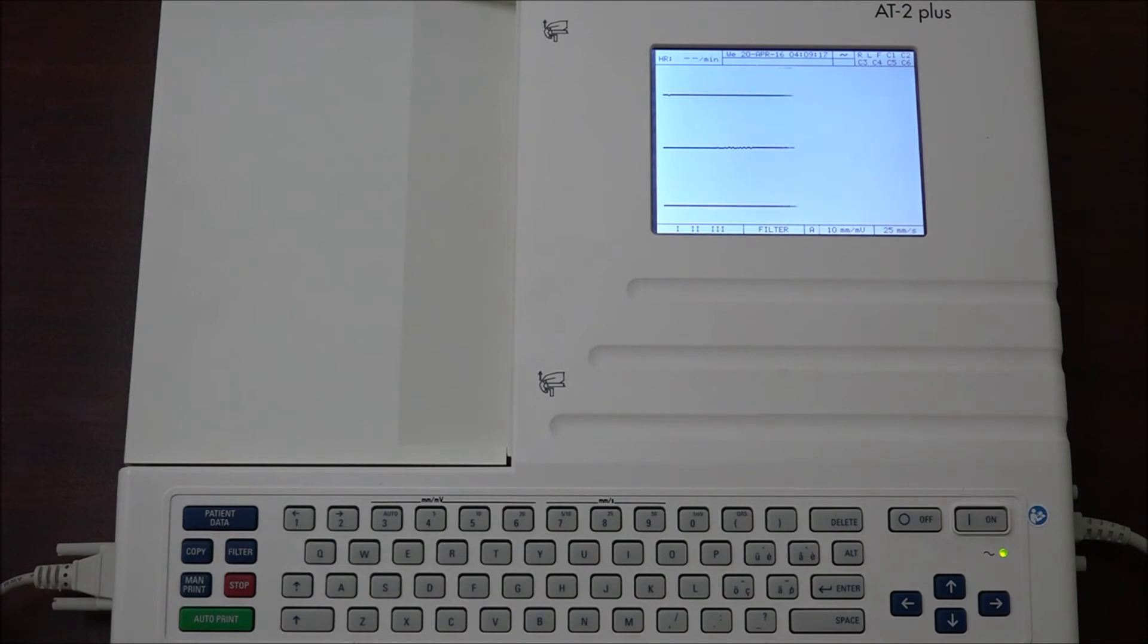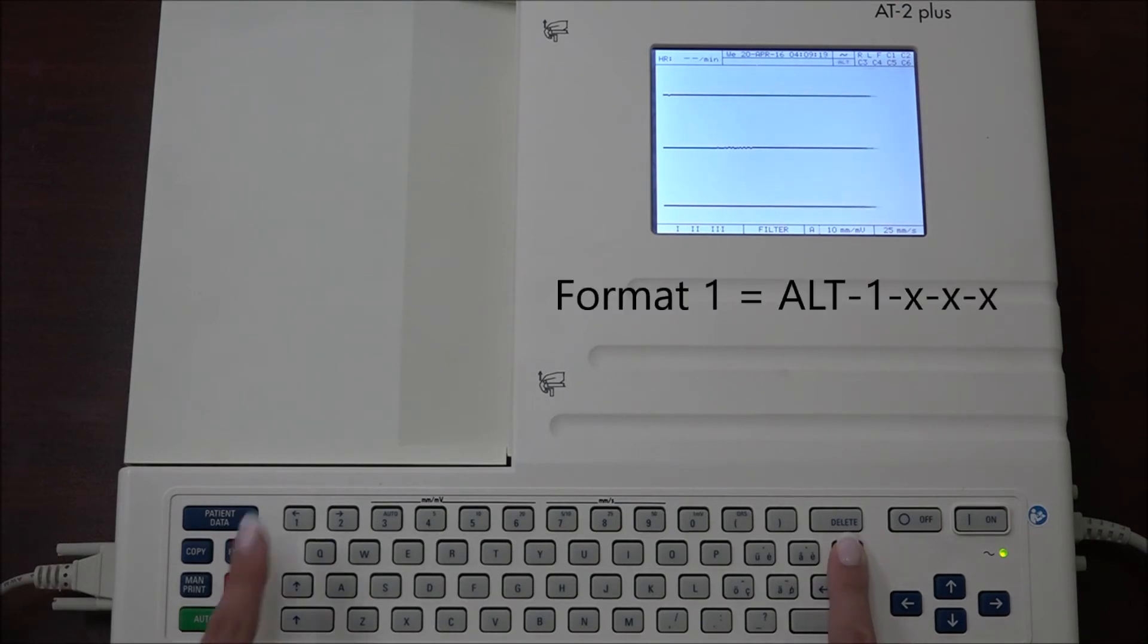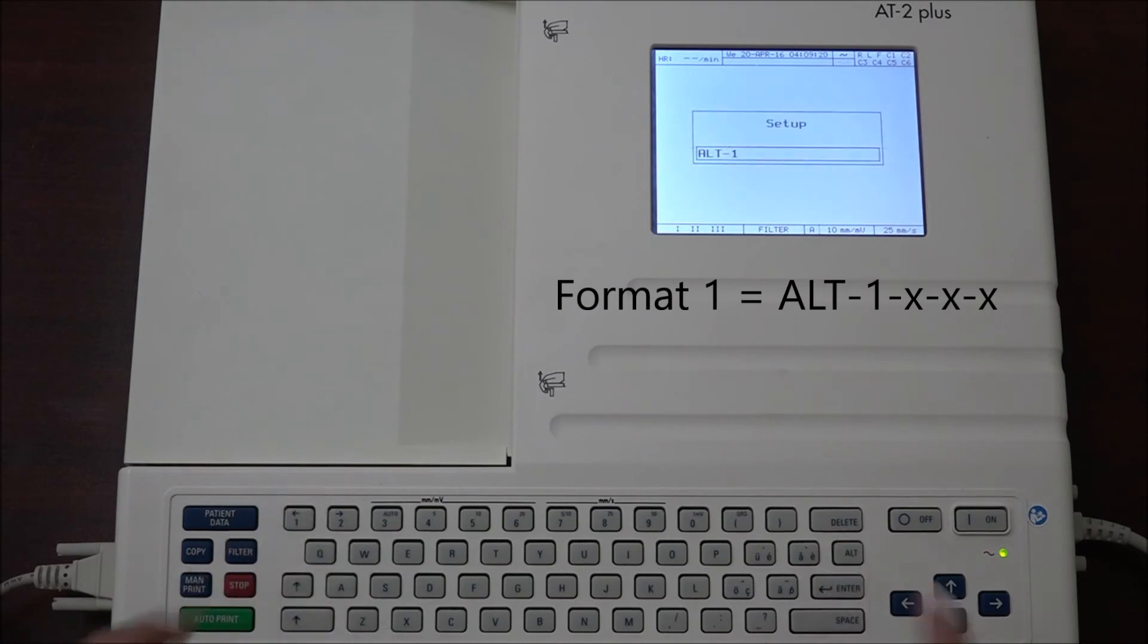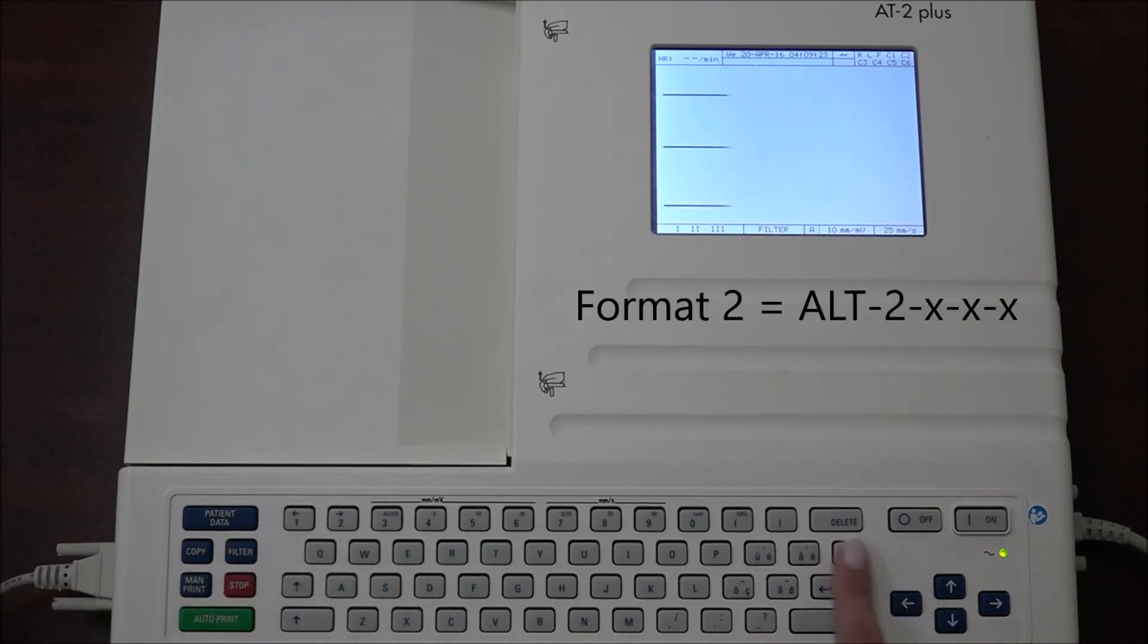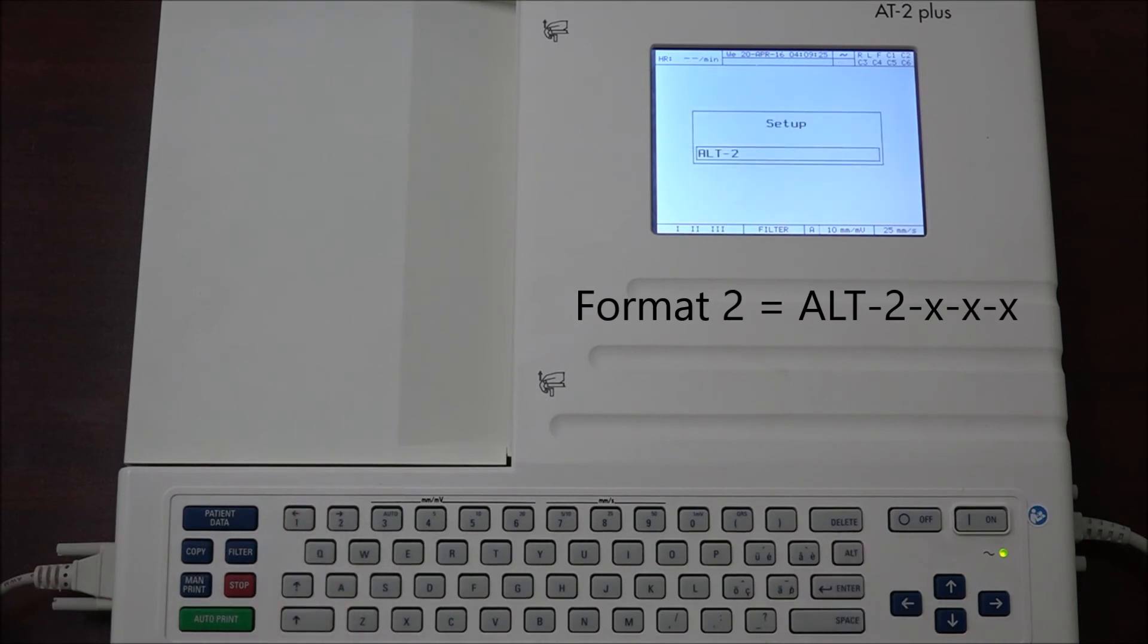Two separate auto formats can be defined for the AT-2 plus. When defining auto format 1, the key sequence ALT 1 precedes the setting. When defining auto format 2, the key sequence ALT 2 precedes the setting.